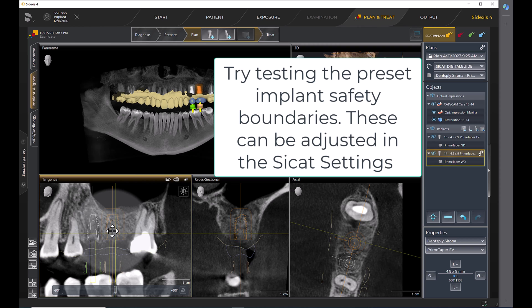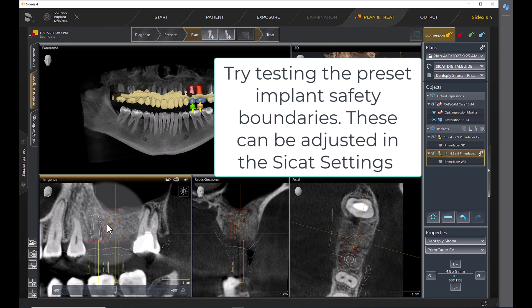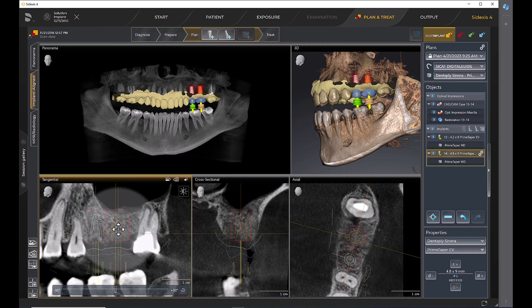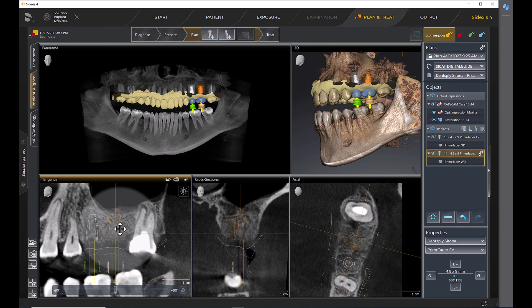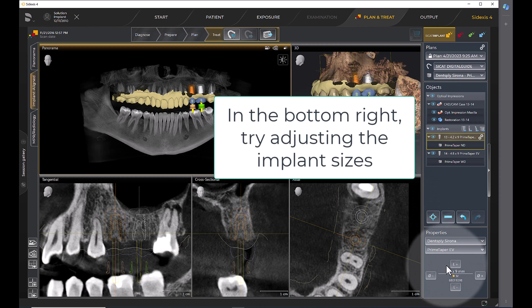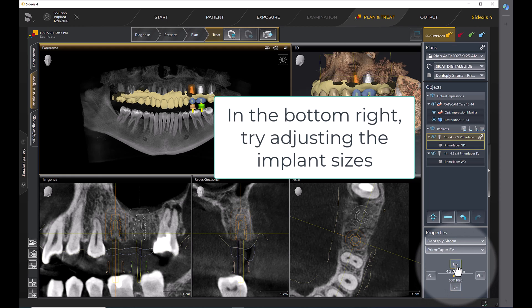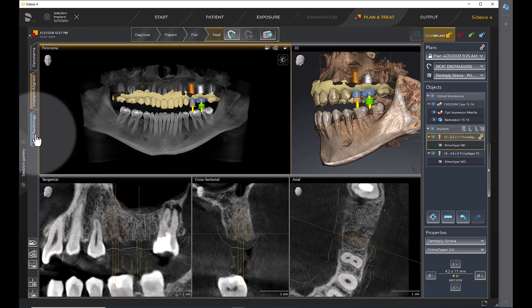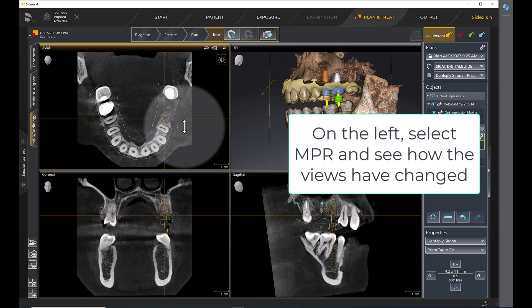The Implant Safety Boundaries can be adjusted in the SICAT settings. In the bottom right, try adjusting the implant sizes. On the left, select MPR and see how the views have changed.